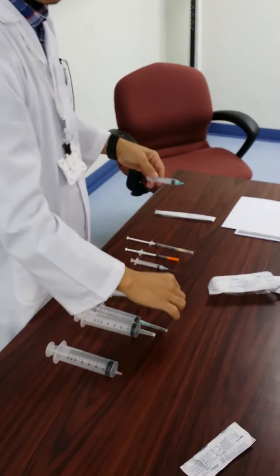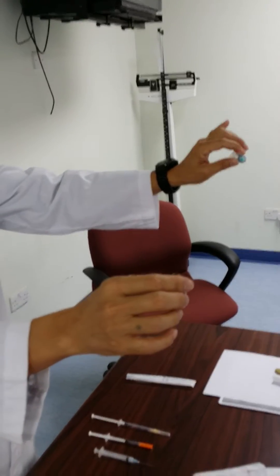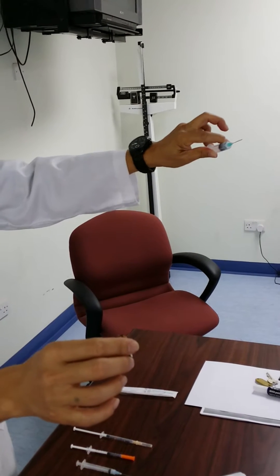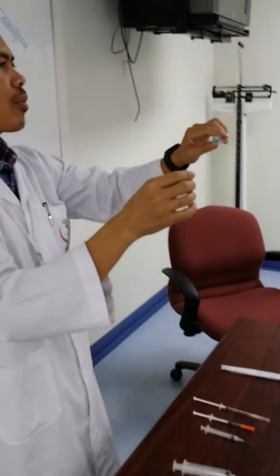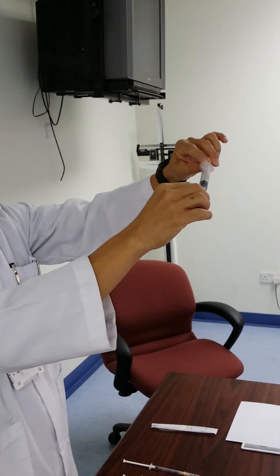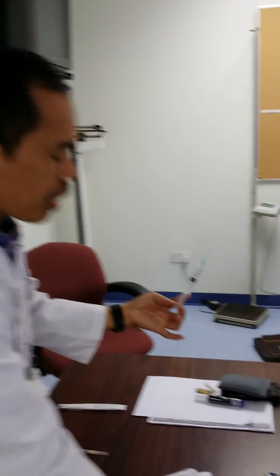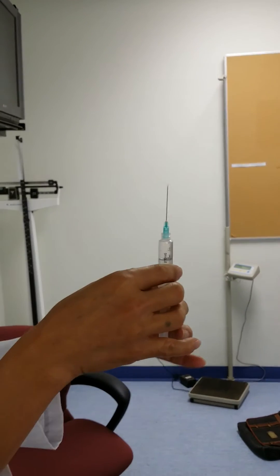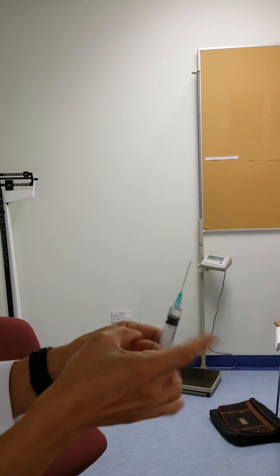I will aspirate all the medicine. This is the technique — hold the syringe by the barrel and pull the plunger. I will aspirate now. At the middle of my eye level, I will aspirate the whole medicine contained in the ampule. All the drugs are taken very easily. If you check it and there is air, you prick it, then repeat the plunger. You get the medicine very easily.